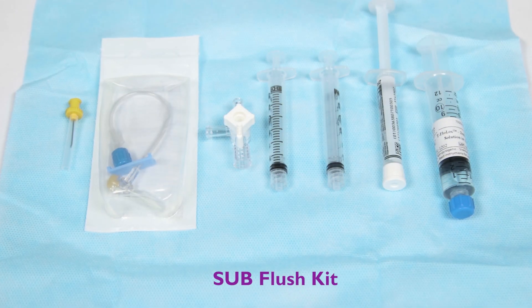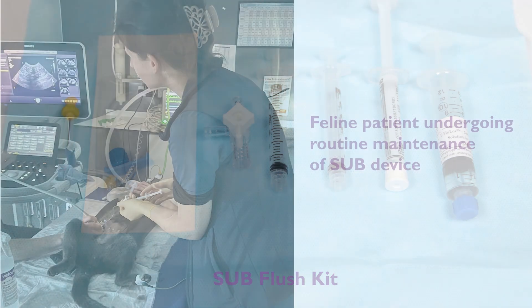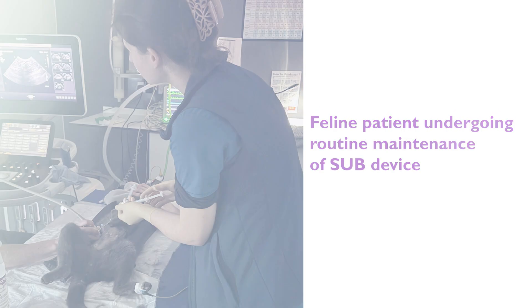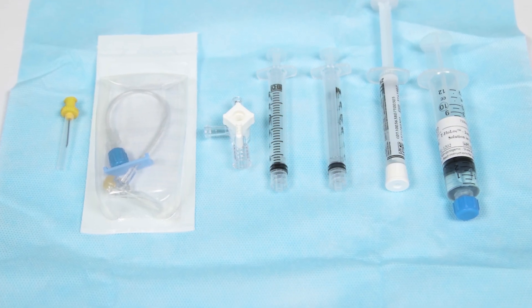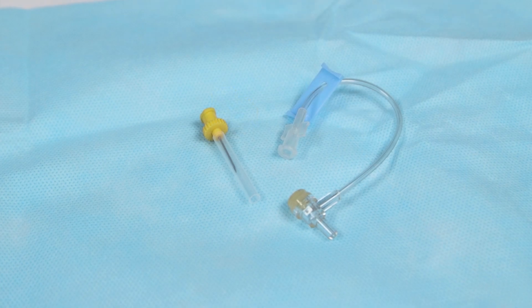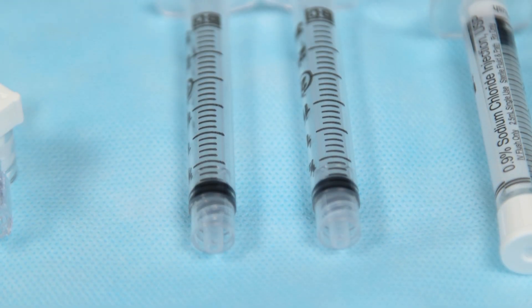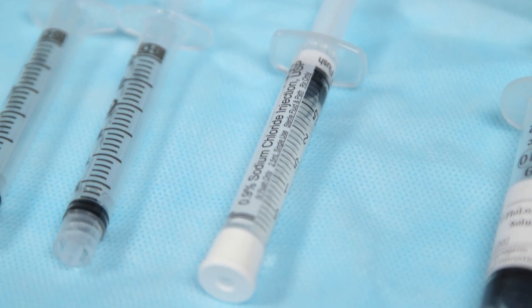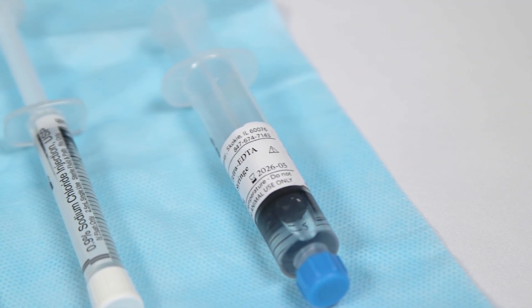Subcutaneous ureteral bypasses require regular management to maintain patency and minimise complications, including mineralisation within the catheters, infection, or obstruction. Every three to six months, the device is flushed under ultrasound guidance using the SUB flushing kit. The flushing kit contains an atraumatic non-coring Huber needle, which prevents damage to the subcutaneous port, a T-connector and three-way tap, two 2.5 millilitre syringes for urine sample collection, a syringe of 0.9% saline for flushing the device, and a tetrasodium EDTA solution to prevent device obstruction.